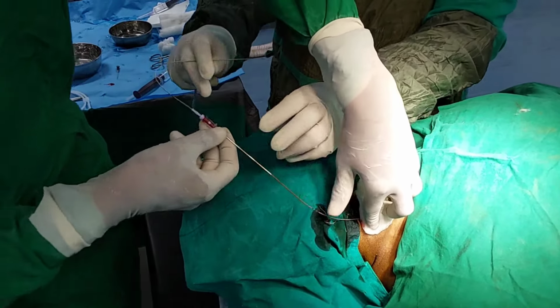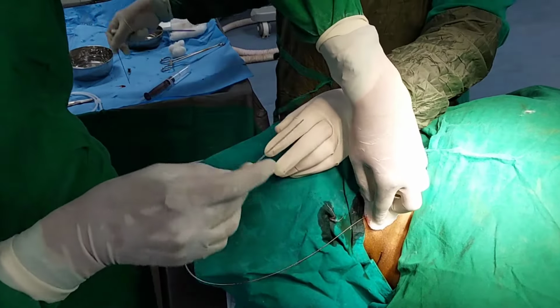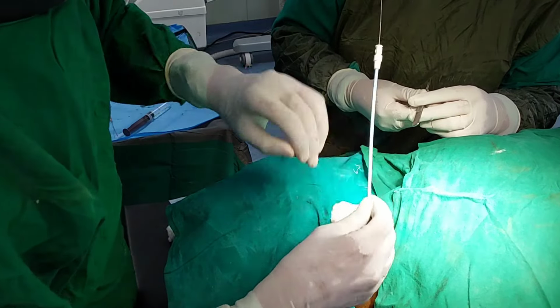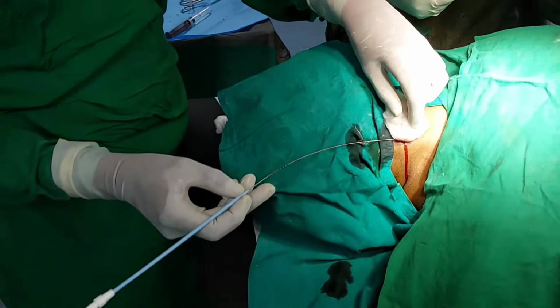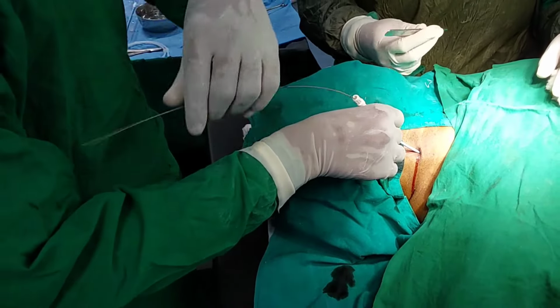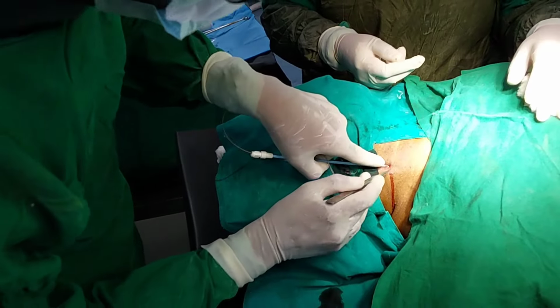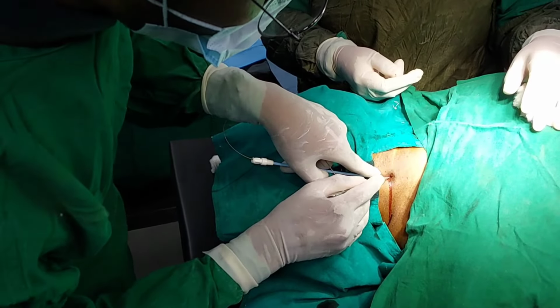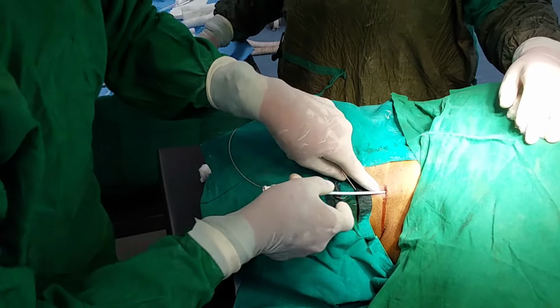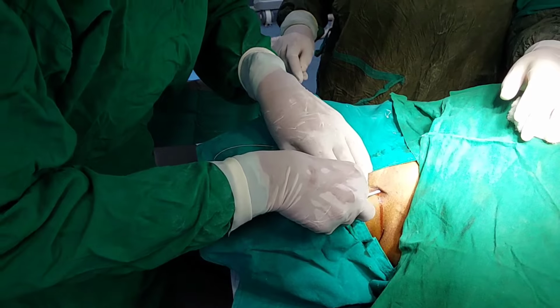You can see in this video that the introducer needle is being removed. Then the small size dilator sheath is passed through the guide wire. See, the small nick was taken using an 11 number blade. Then the dilator sheath is passed. This is a small size dilator sheath. After this we will change it with the large size dilator sheath.